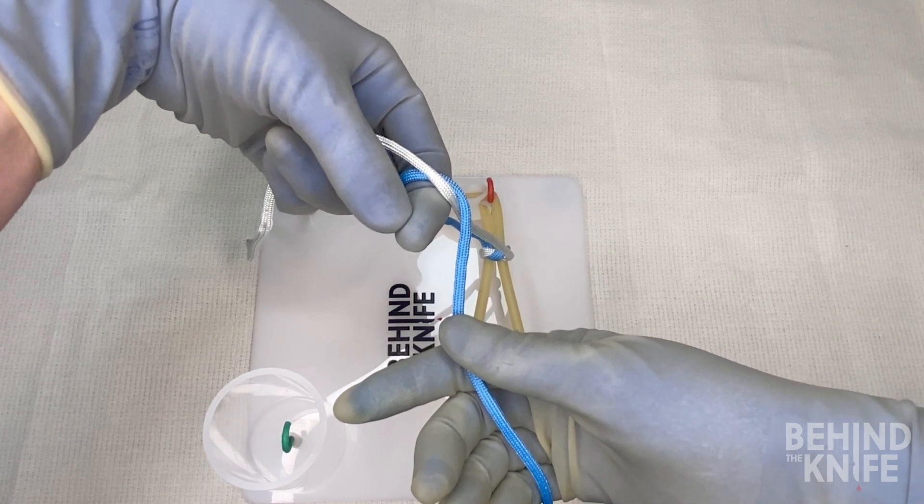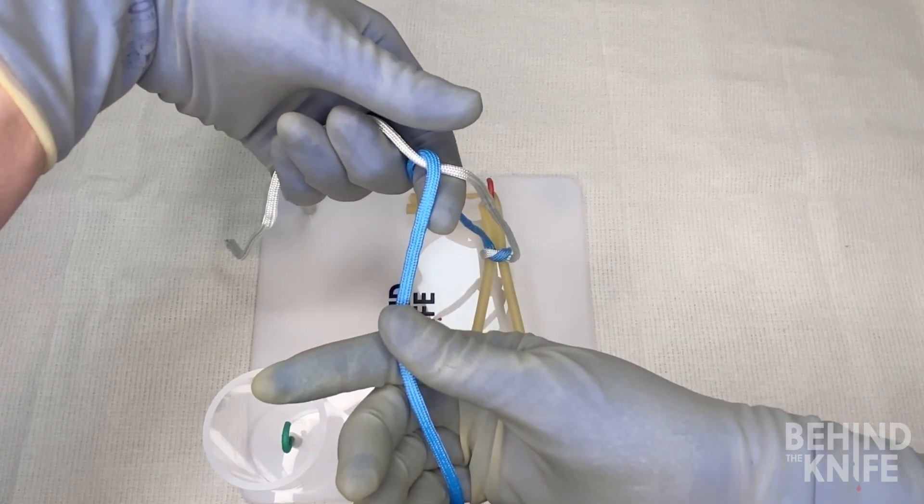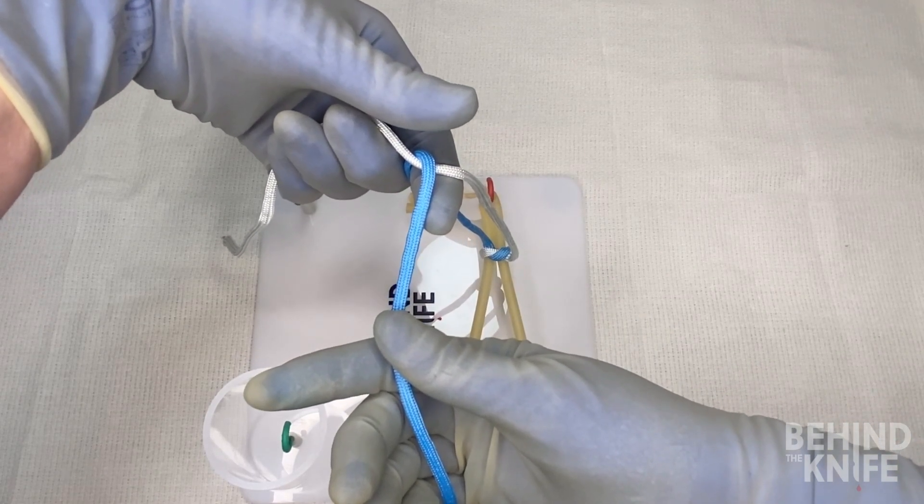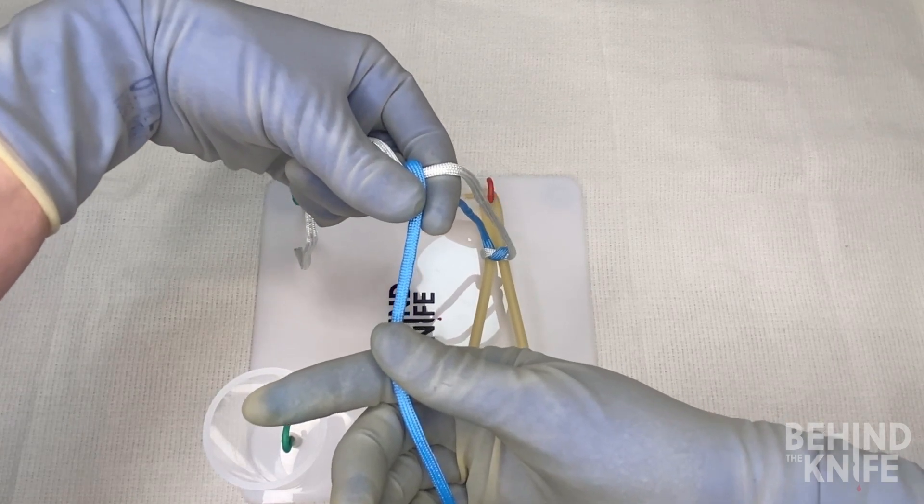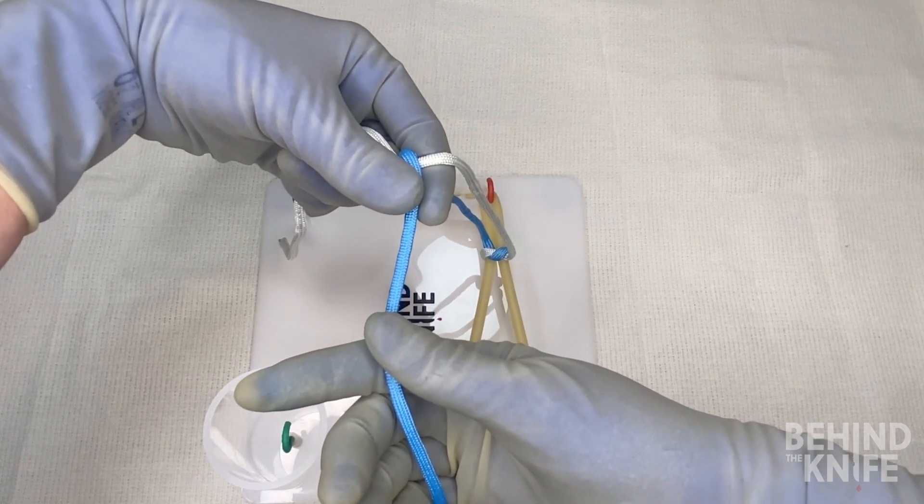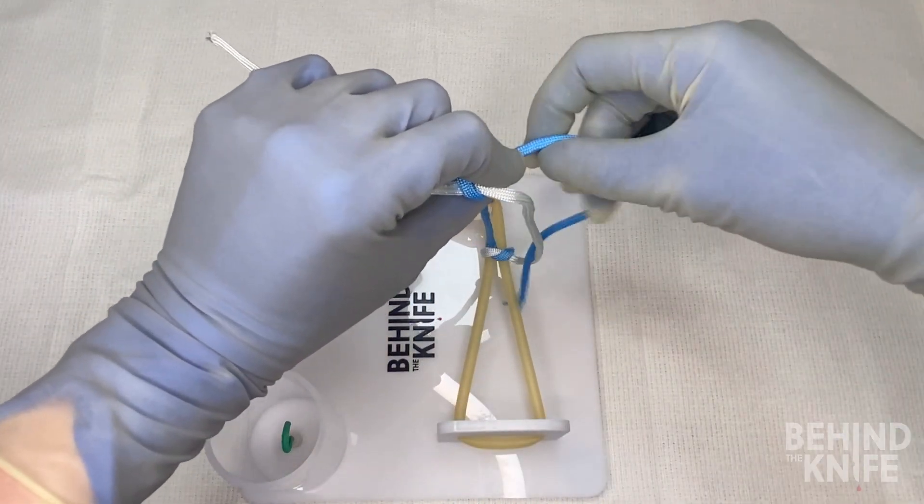We'll take the blue end of the string that's in our right hand, and we'll place it over top our index finger, and we'll re-pinch our thumb and our index finger, this time with the blue string in between, and rotate our hands back through, bringing the blue end of the string with us.